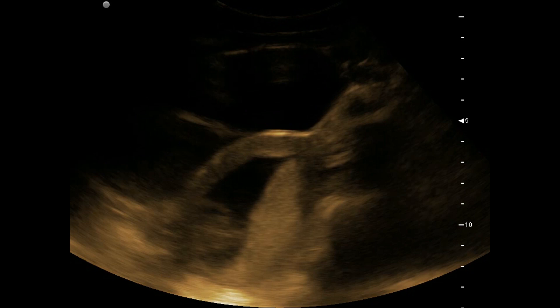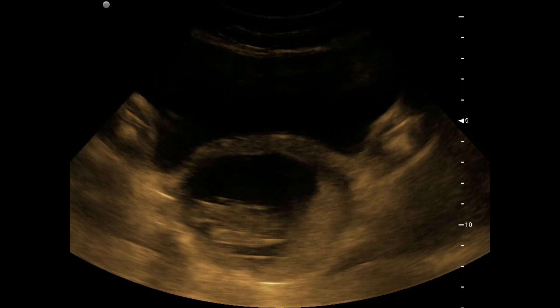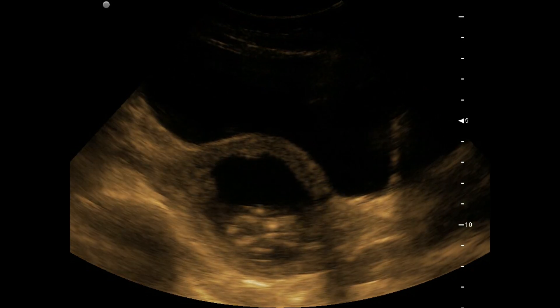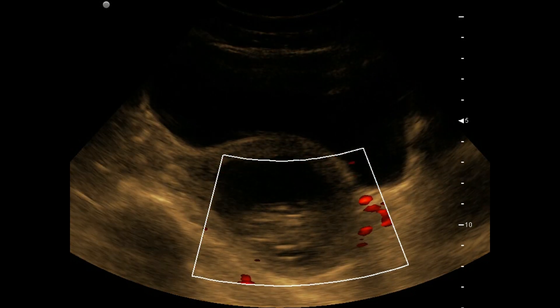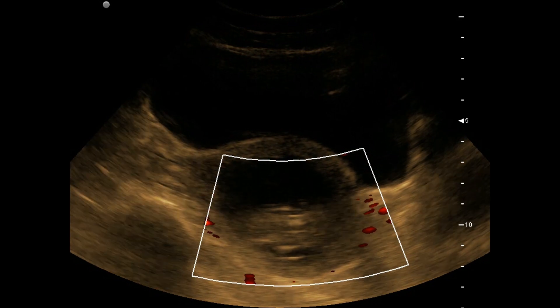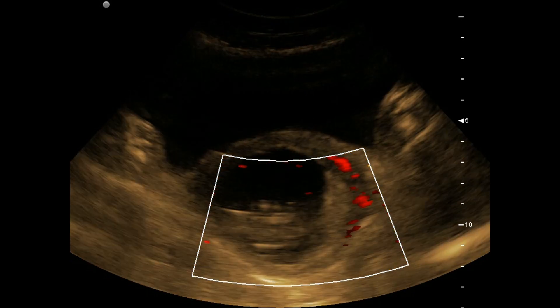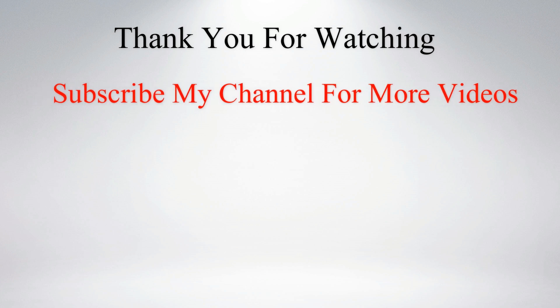You can also see a posterior placenta here. That's all for today. Thank you.